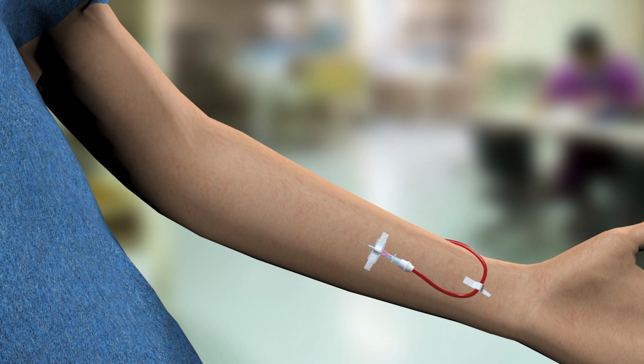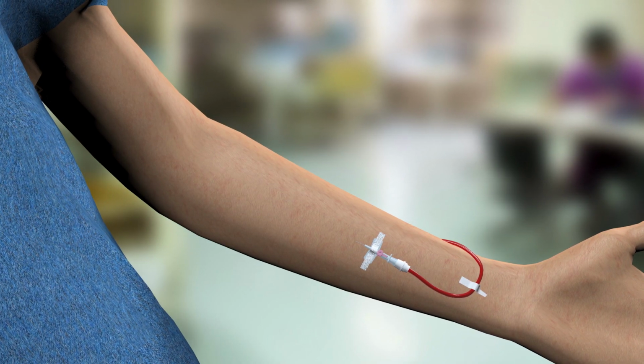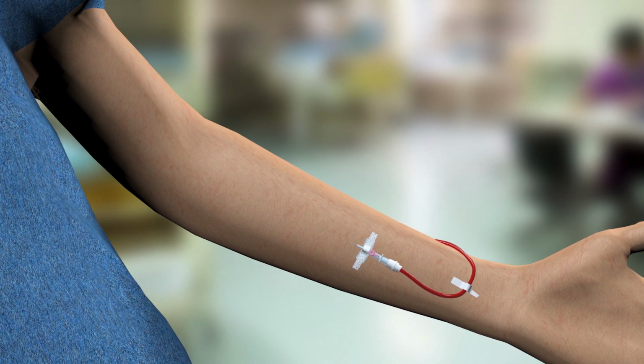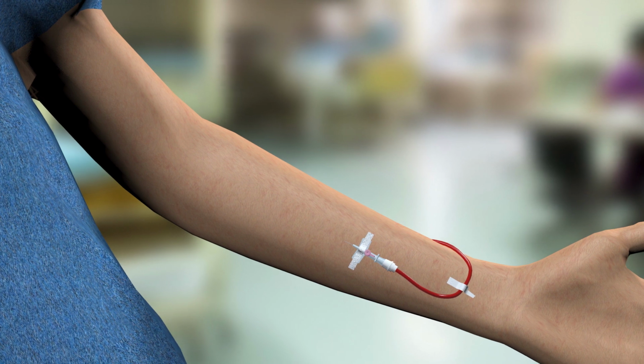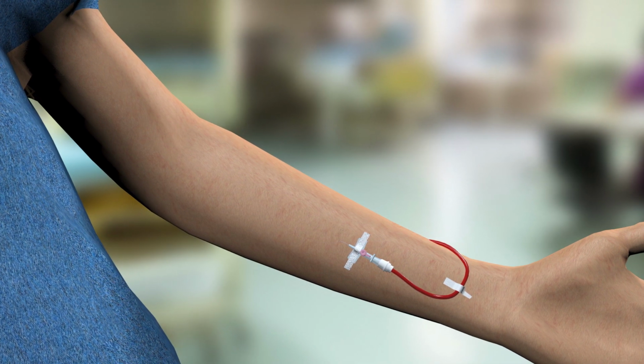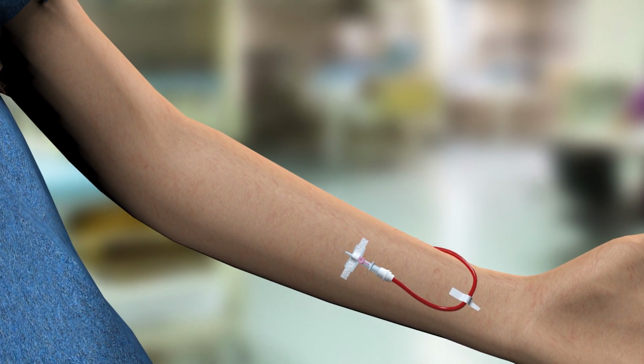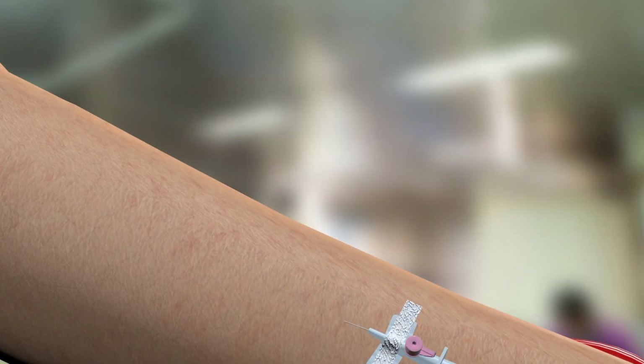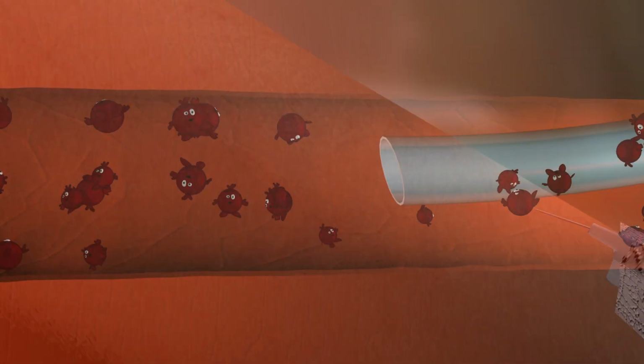Vascular access devices are the most commonly used medical device in healthcare today. Over 90% of patients will require some sort of vascular access to facilitate delivery of essential drugs and fluids, while 70% of all hospitalised patients will require a peripheral intravenous catheter.